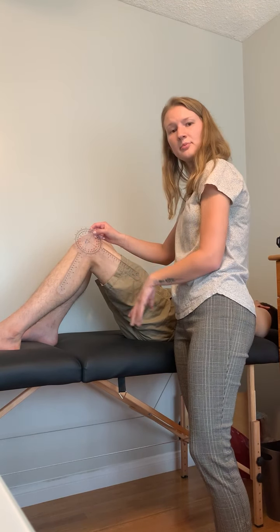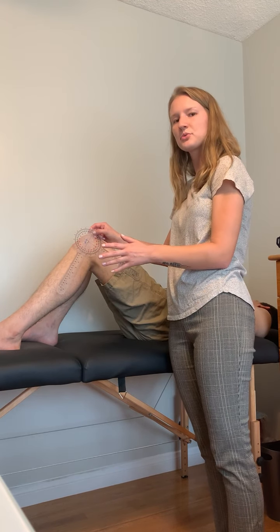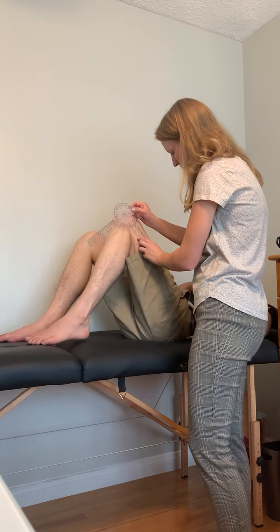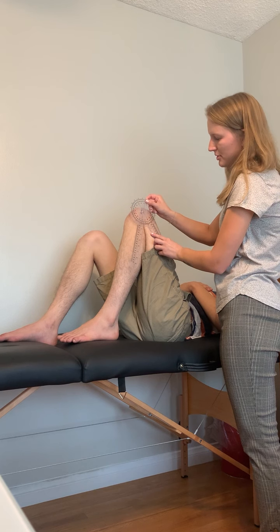And then I'm going to have him bend his knee in without letting the foot come off the table because that would involve some hip motion. We just want knee motion here. So go ahead and bend. See how I can move the moving arm with how the knee just bent?